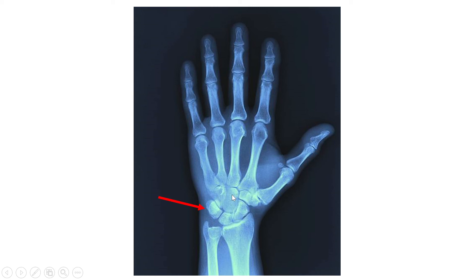Now these are the metacarpals — there are five metacarpals: first, second, third, fourth, and fifth. We identify the first because it is short and stout compared to the other four metacarpals. These are the phalanges — there are 14 in number: two for the thumb and three for the other fingers.